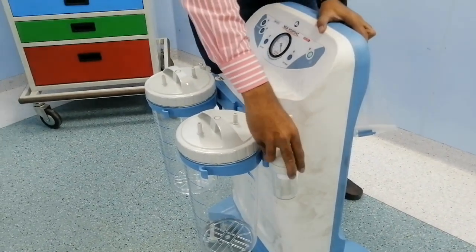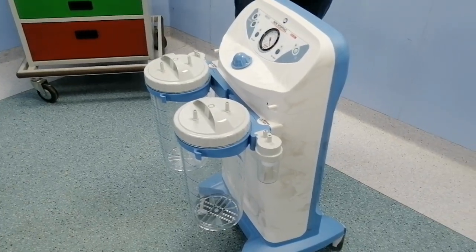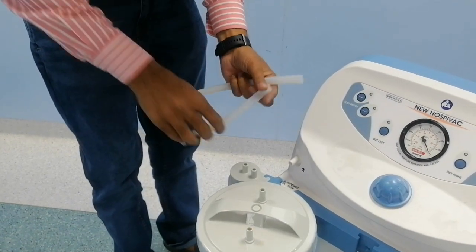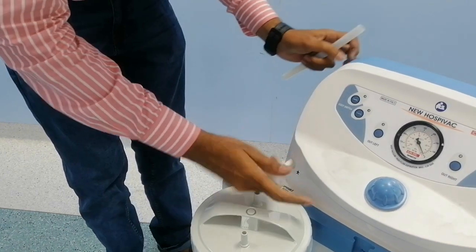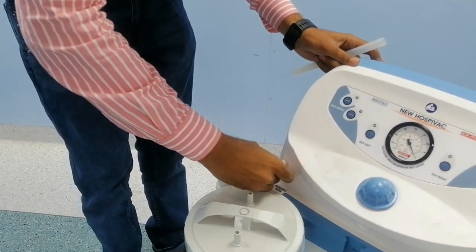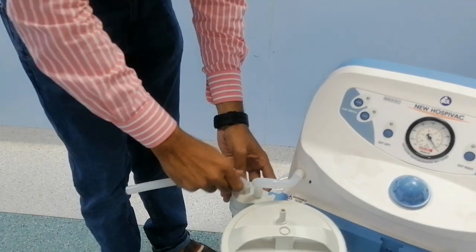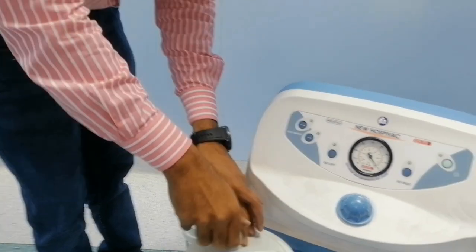The external bottle is for safety and is installed on the right side and the left side of the suction machine. After installation, connect the pipes from the main suction unit to the small bottle, and from the small bottle to the main jars — the same on both sides — for the suction piping connections.